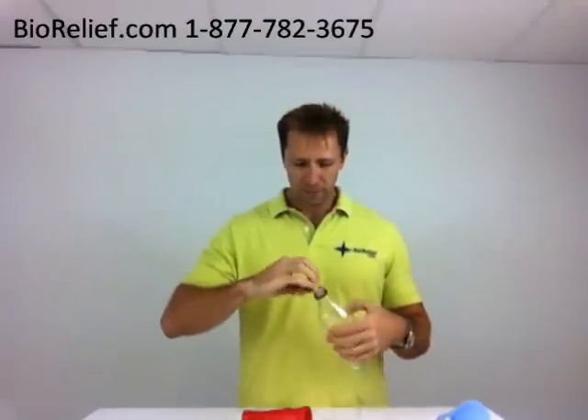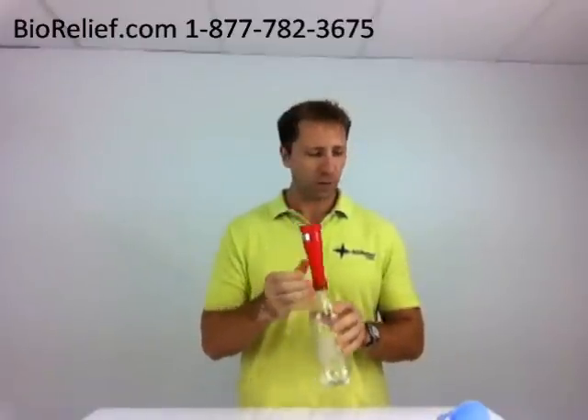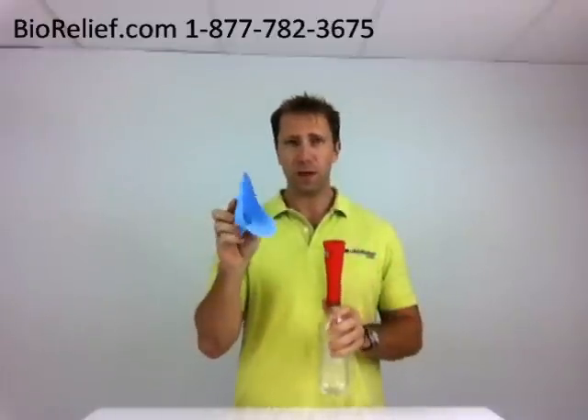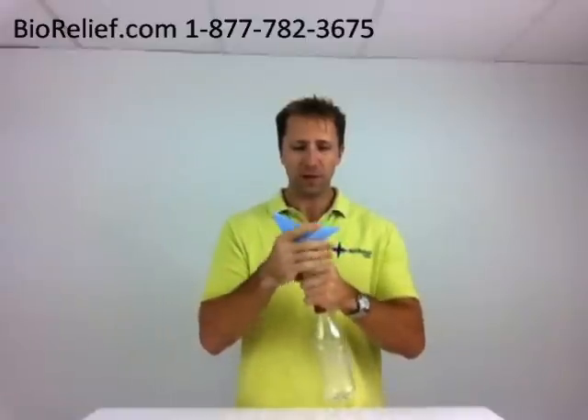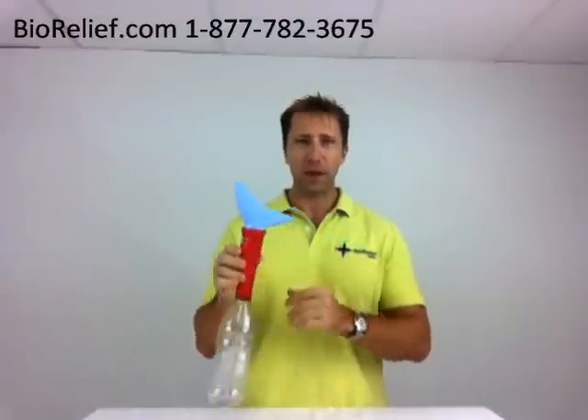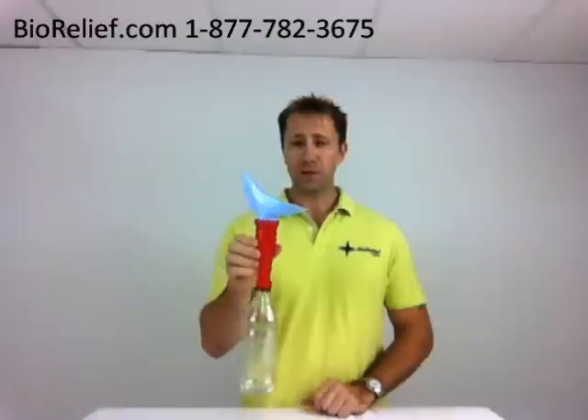The nice thing about this is — this is obviously the male version — but for females, they need to use something called the Lady J. This conveniently fits on top here as it is made to. They can rest this against their body and have the ability to use the G-Funnel for their purpose.